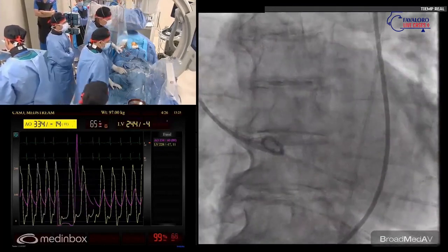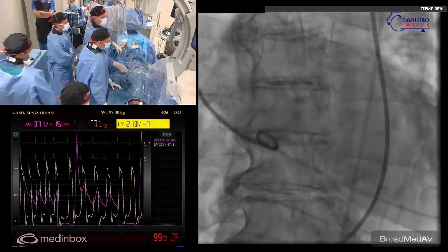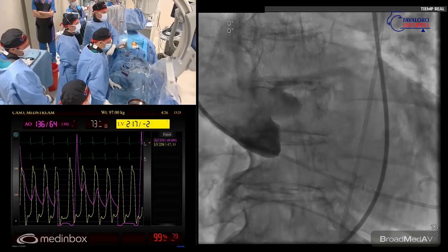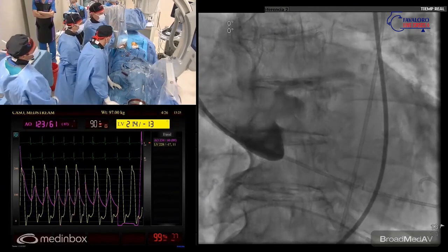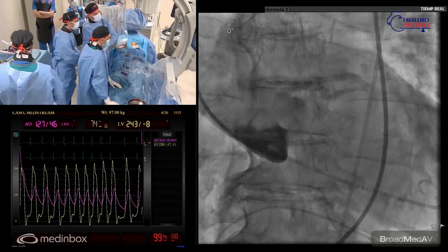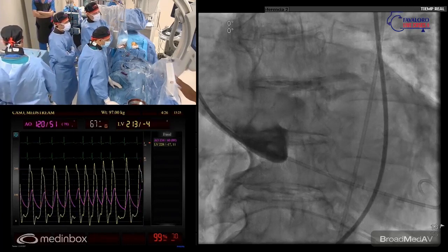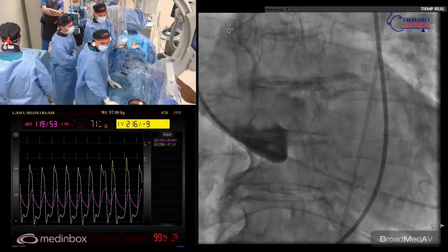Here, this is the coplanar view. Okay, yeah. You cannot see the right very well, but we can see it from here. There, exactly. You can see the right, in the middle. So it's exactly zero. Good view.